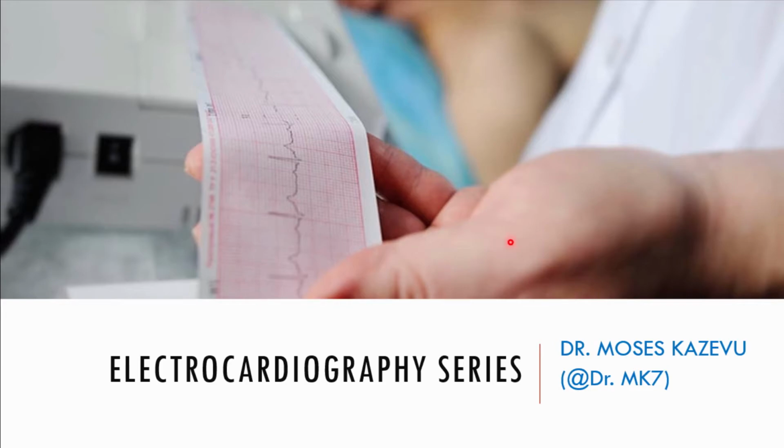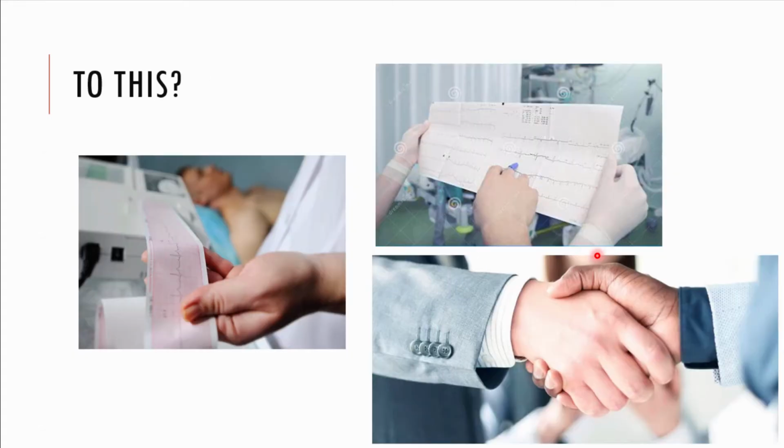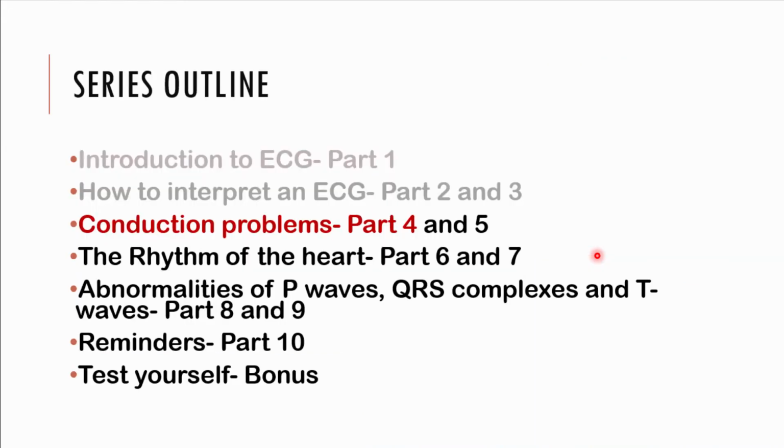Now these are a series of lecture videos that are getting you from being confused about what you're looking at concerning the ECG to becoming an expert at the ECG. And in this lecture video, we shall look at the introduction to conduction problems. We'll look at heart block, we'll look at bundle branch blocks, and then we'll conclude conduction problems in part 5 of these lecture videos.